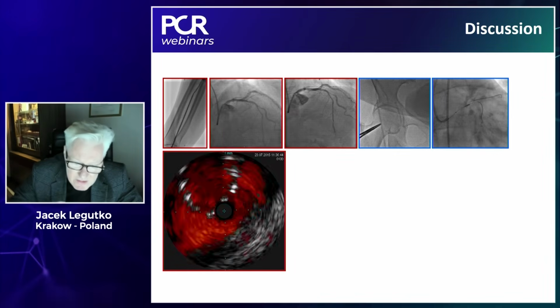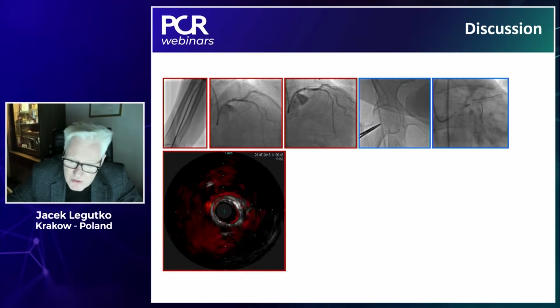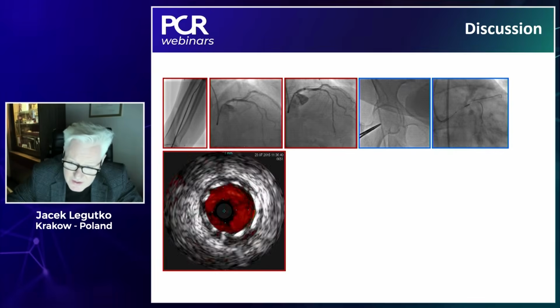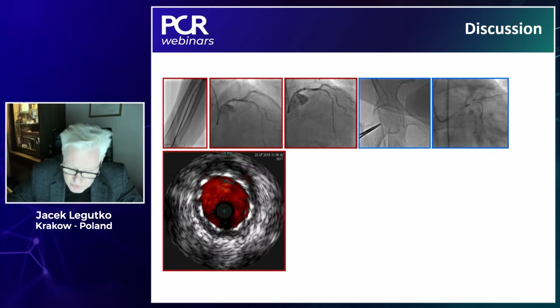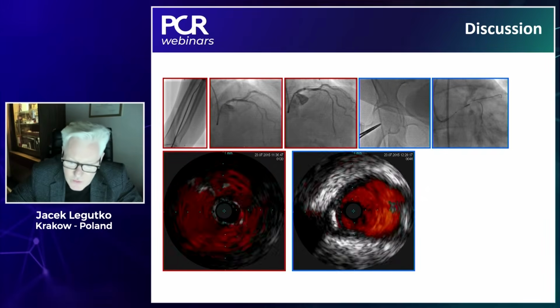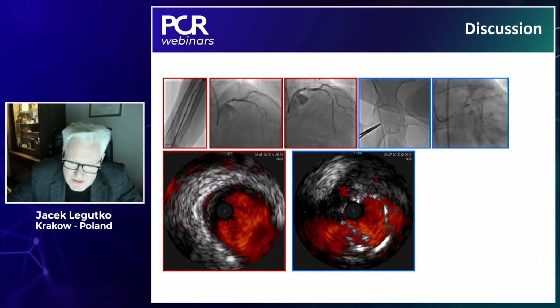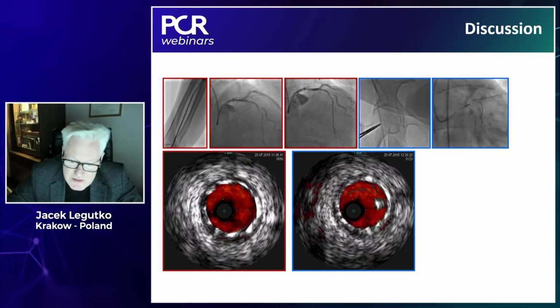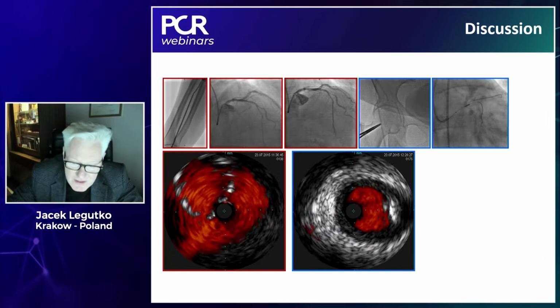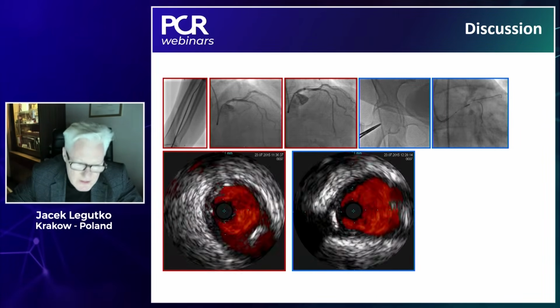And so knowing that I was not in a good position, I changed to femoral approach, changed to the Judkins guiding catheter, and using my 2 wires approach, I finally engaged the wire through the stent, and now you can see the pullback, and you can also see now the stent distortion. So during all these maneuvers, before the diagnostic cath and the first attempt, we damaged the stent in the aorta.